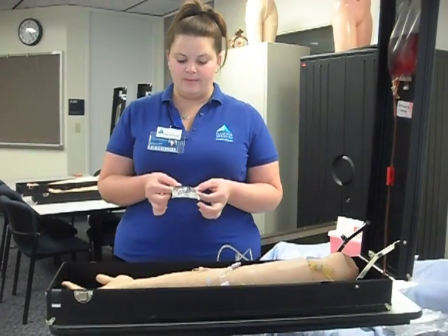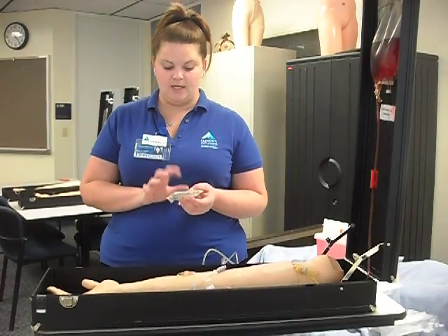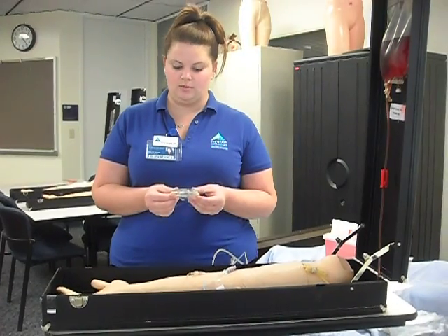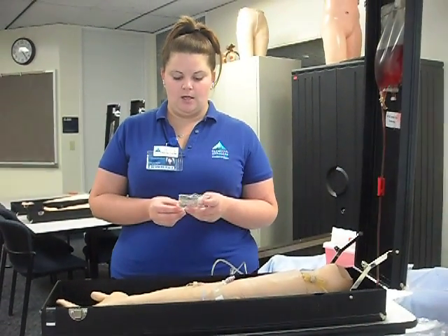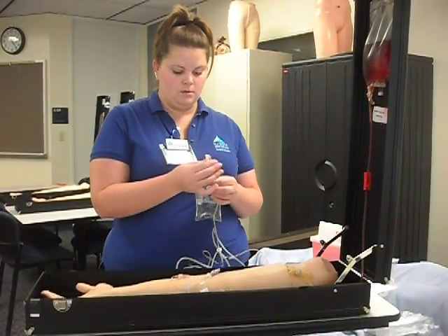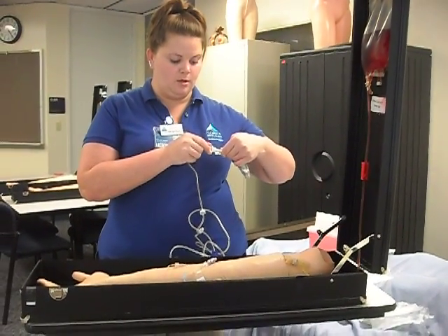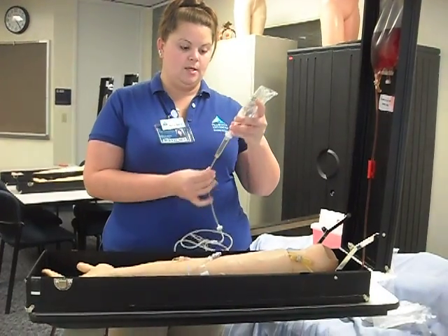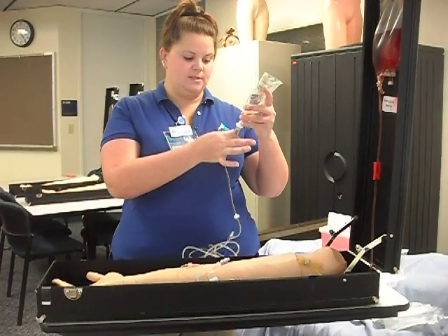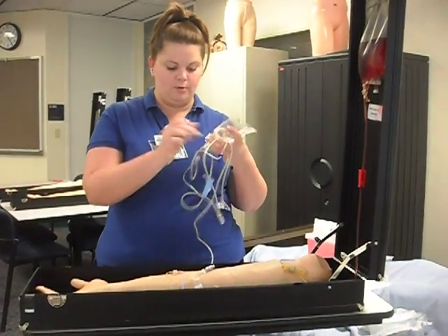I am going to label my bag with the drug, the patient, the date, the time, the dose, route, initials, anything that is relevant to the medication. And I am going to set my tubing up. And I'm going to label my tubing also with the date, time, and initials. And I am going to prime the tubing by squeezing this, making sure the medication goes throughout the tube. And I'm going to close the roll clamp.